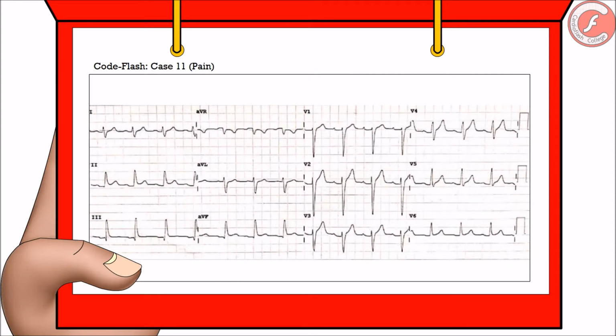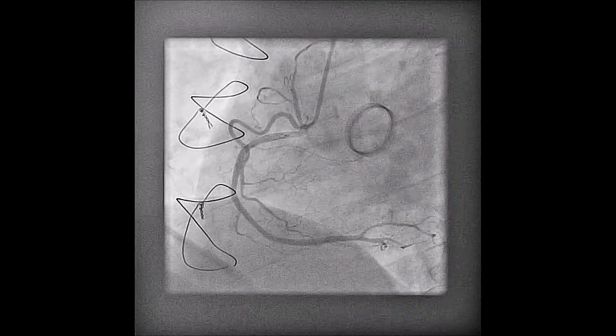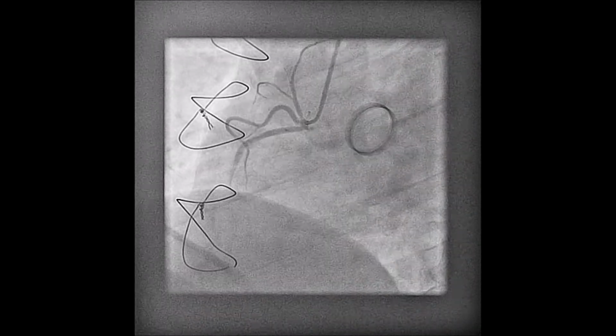In this way, the patient was moved to our health center with a diagnosis of an ST segment elevation acute coronary syndrome, reasons for which, although clinical findings were not solid enough, cardiac catheterization was performed. As you can see, the right coronary artery is open and it does not present any significant lesions.